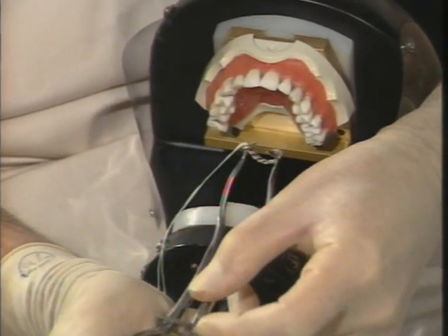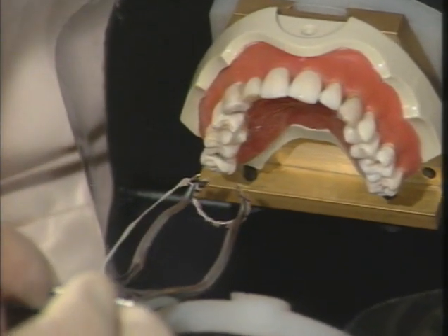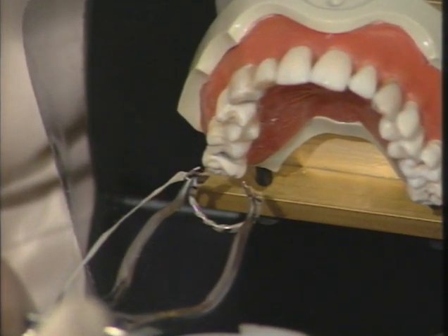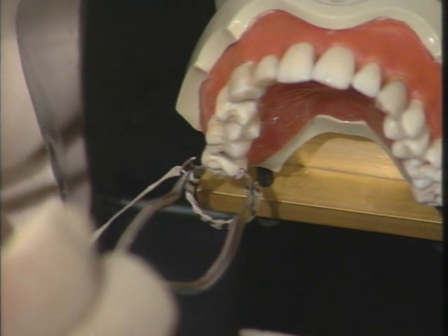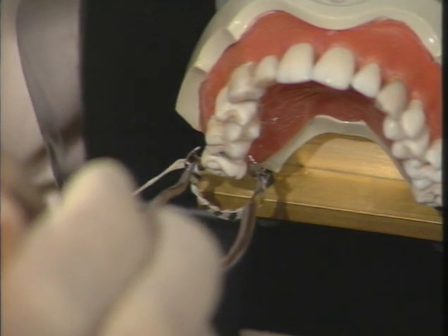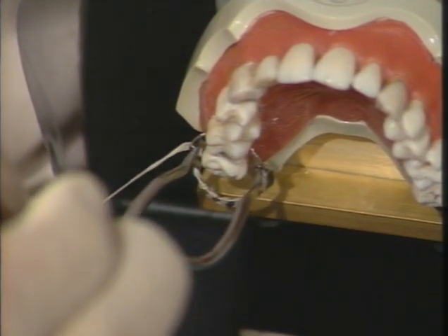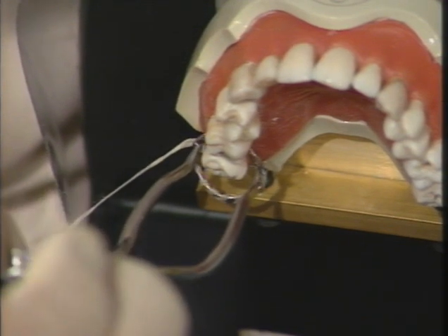To place the clamp onto the tooth, I just loosen the forceps themselves, carry the clamp over towards the posterior anchor tooth, place the jaws of the clamp against the palatal surface, and then slide the buccal jaw down against the buccal surface of the tooth until it clips into the gingival crevice.